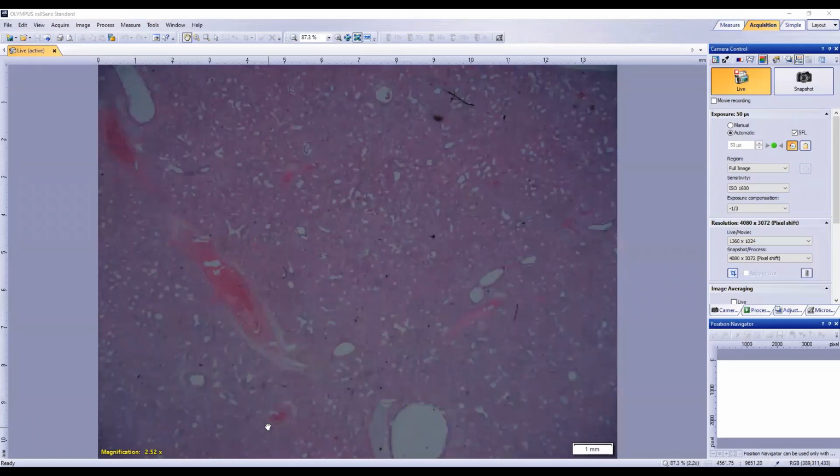So in that case, starting from the alveoli. Exactly. Yep. So the alveolar lumen, and then. At the moment, we're just looking for a list of things to look at. We don't have to describe the features just yet. All right, you're all good.